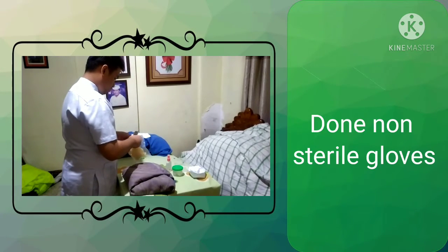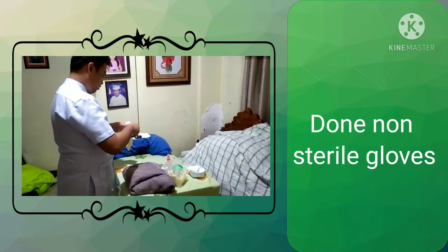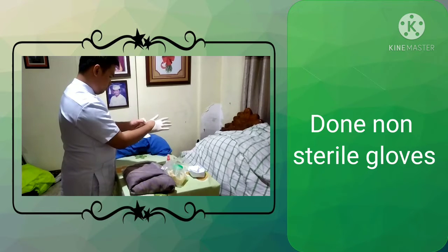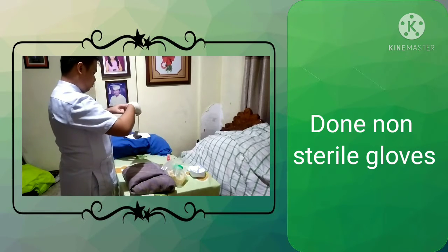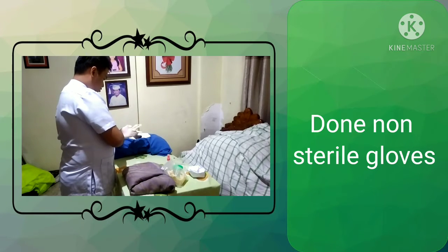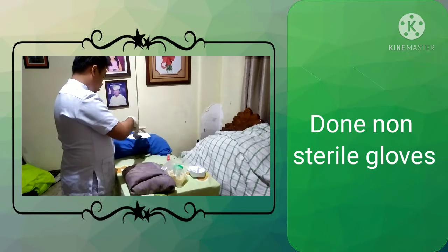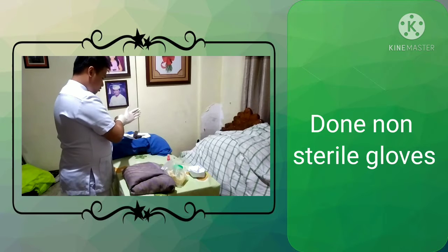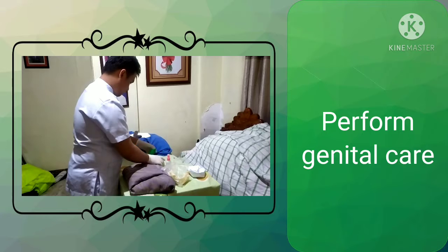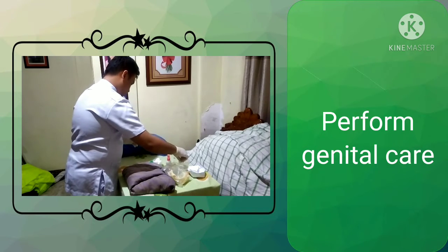Don non-sterile gloves. Using soap, water, and washcloth, perform genital care to the patient.